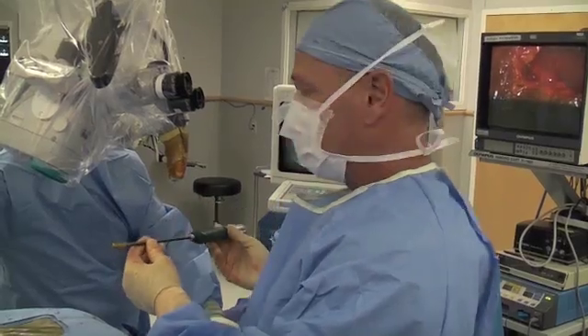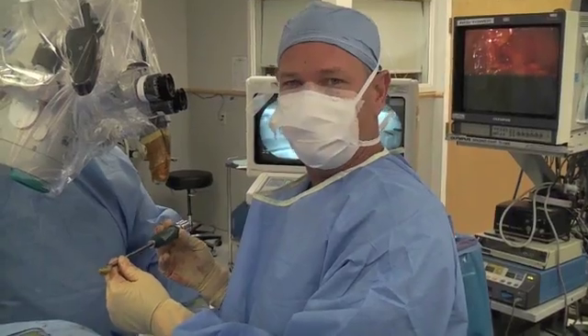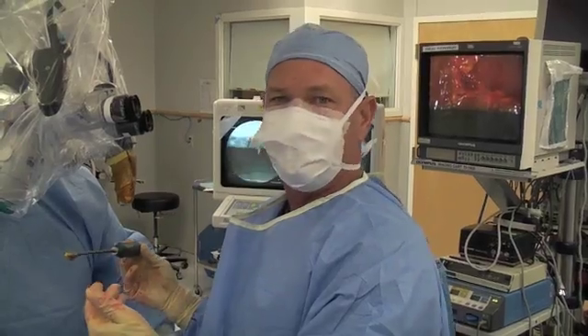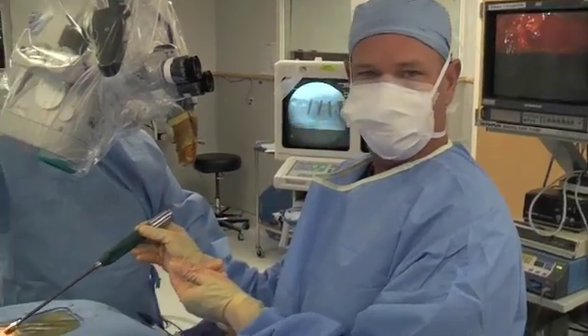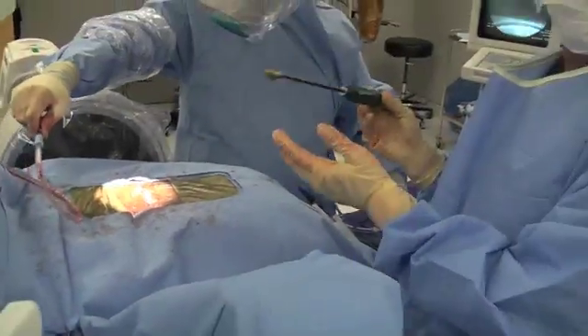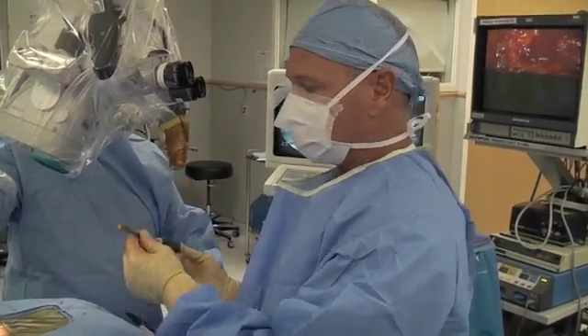I really like it. I want to show you how to do it. I've already done all the disc work — taken out the disc, decorticated the end plate. All the same tools from the old TPAL system are used for the decortication and discectomy. We've done it microsurgically. You can see the wound I use right here. At this stage, I've already created my bony orifice — a direct window inferior to the foraminal segment of that nerve root, and above that pedicle, taking me right into the interbody space.